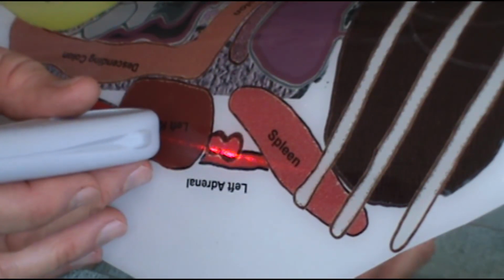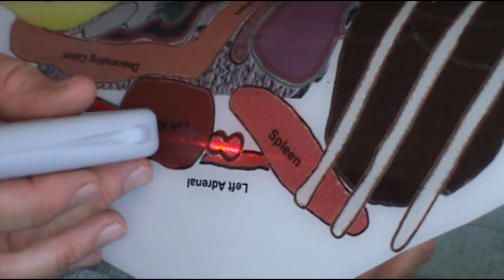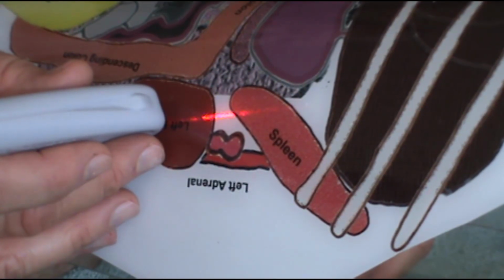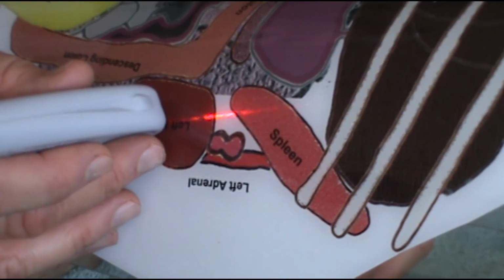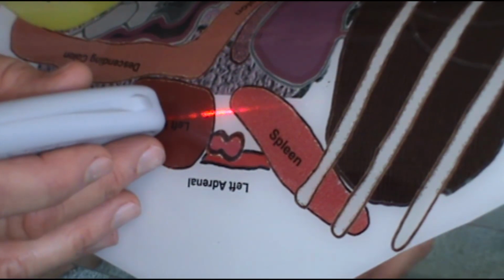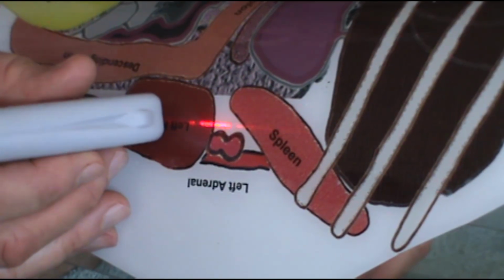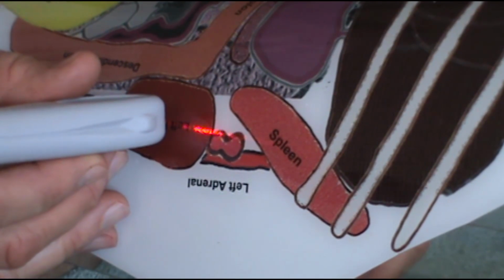When looking for the left kidney, a common mistake of the sonographer is to rotate the transducer slightly counterclockwise from a sagittal position. This mistake shortens the length of the kidney and will result in an inaccurate kidney length measurement. It also moves the ultrasound beam away from the left adrenal and makes it much more difficult to find the left adrenal from a lateral sagittal transducer position. It is important to keep the ultrasound beam parallel to the tabletop.